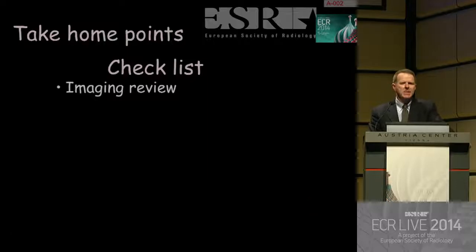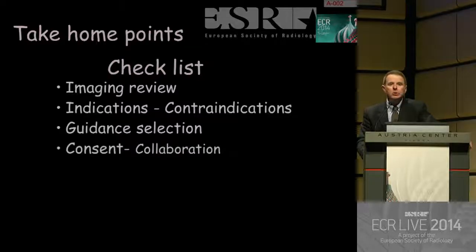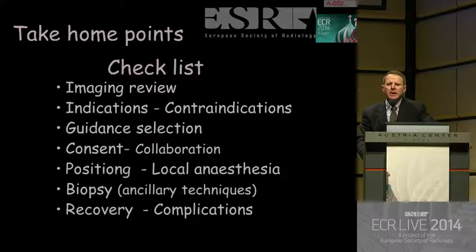You have to remember: never, never schedule a biopsy without reviewing the imaging. Balance indications and contraindications. Select what is the best guidance for you. Talk to your patient and get the collaboration. Remember that good positioning may be everything, and of course, a well-done local anesthesia is important. Know all the biopsy techniques and all the ancillary techniques to get to your target. Be able to manage the recovery period and be organized to manage all the complications. And hopefully, you will not have complications.